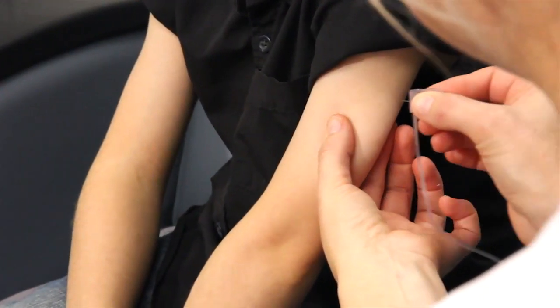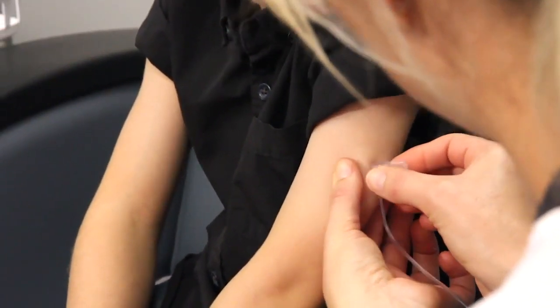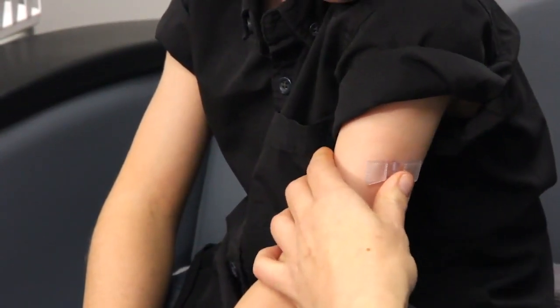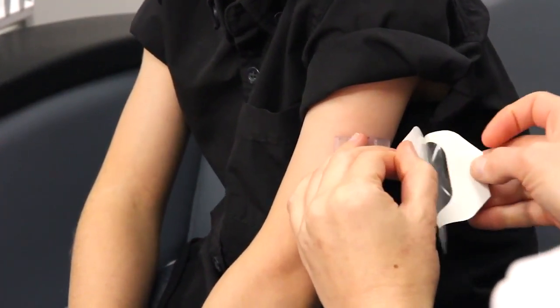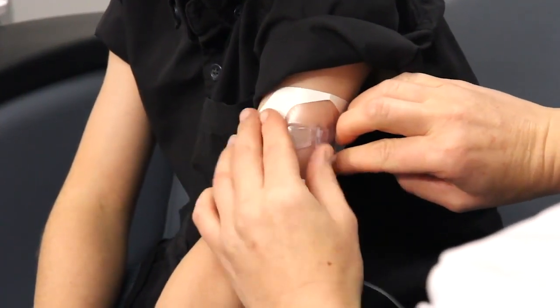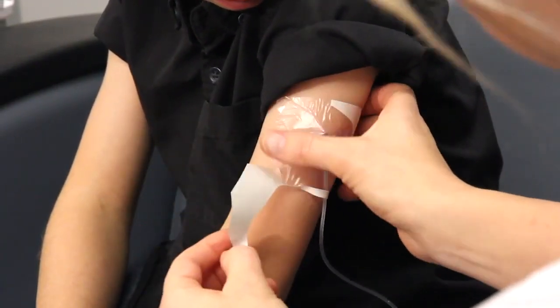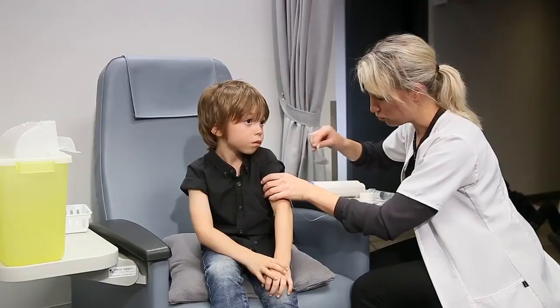Using two fingers, pinch the skin, avoiding the disinfected area. Using a swift motion, insert the needle completely at a 90-degree angle. Cover the needle with the transparent adhesive included with the needle package. Repeat those steps until all the needles are inserted.